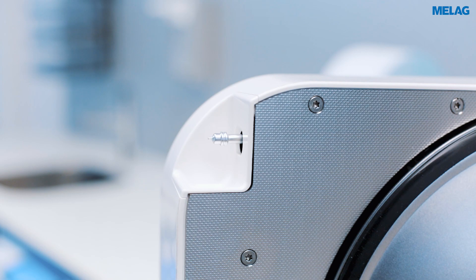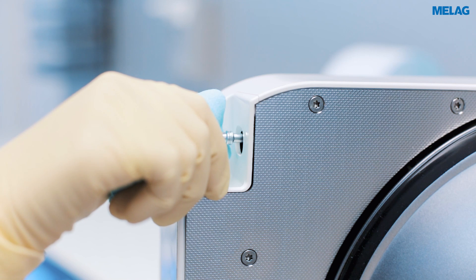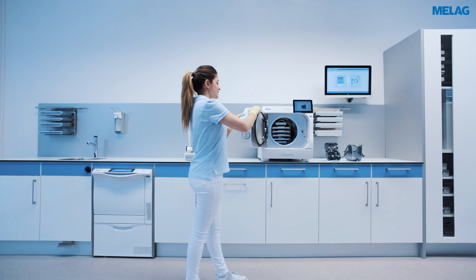Now press the nozzle for approximately 10 seconds. The escaping oil can be collected with a lint-free cloth. At the end of the venting process, your add care unit is once again ready for use.